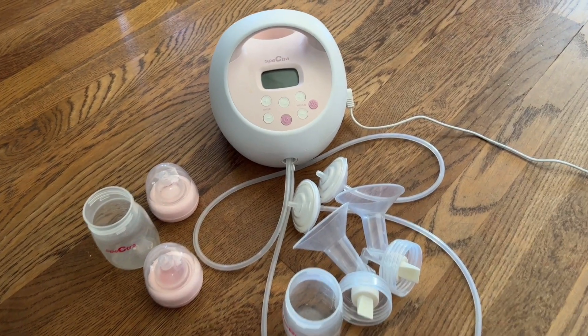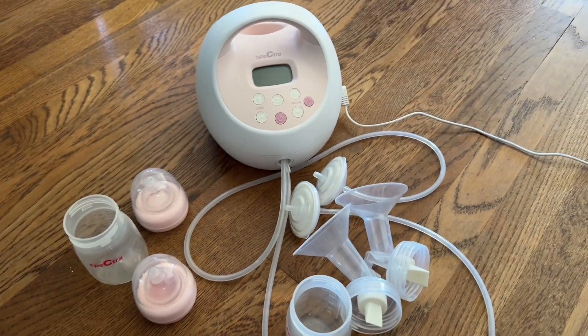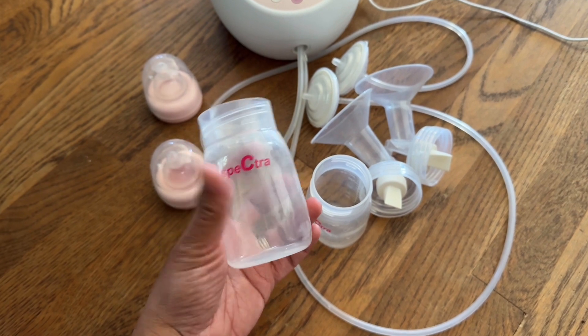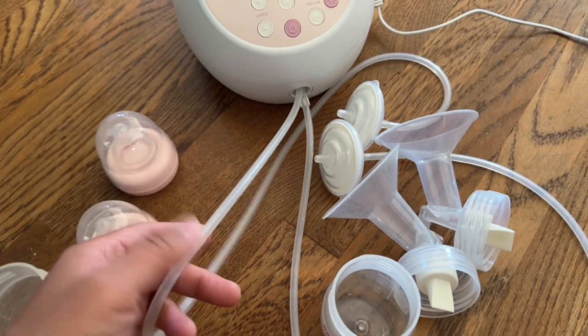It's Leah with another mommy review. This time it is for the Spectra. As you can see, there are a lot of parts to this system. You have your catch bottle — it hooks up to your pump, but when it's not on your pump, you can put the nipple on top of it, just like this.